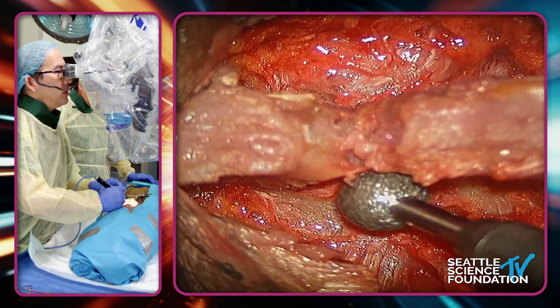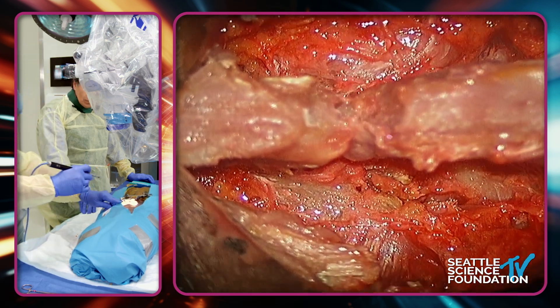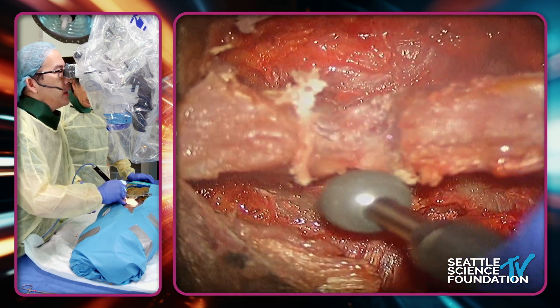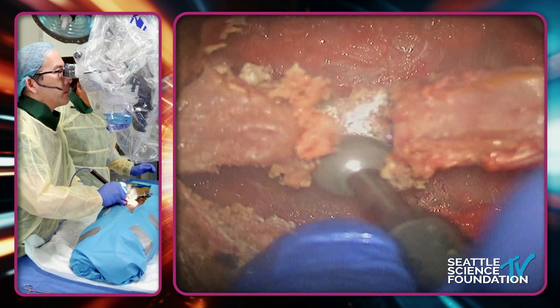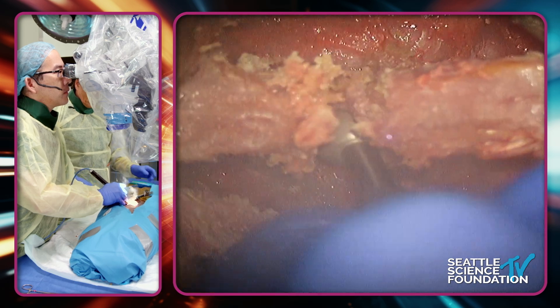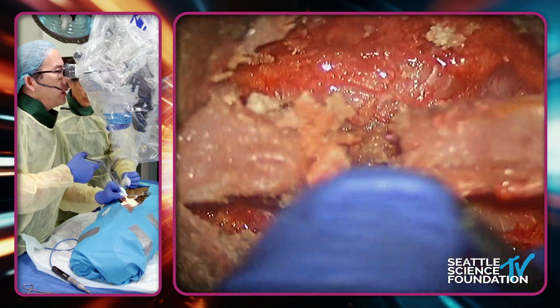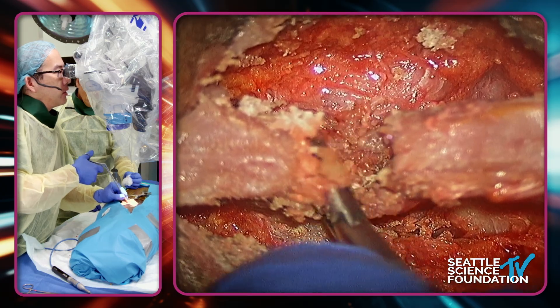Right now what I do — and this can be done very quickly — you just get the drill going and then you cut down to the quick. That takes about 10 seconds and then you're using some sort of rongeur or pituitary to clean out the soft tissue.